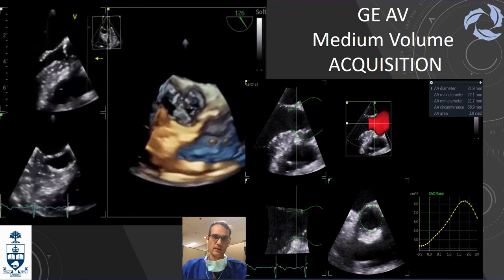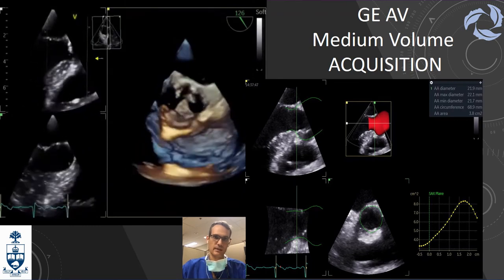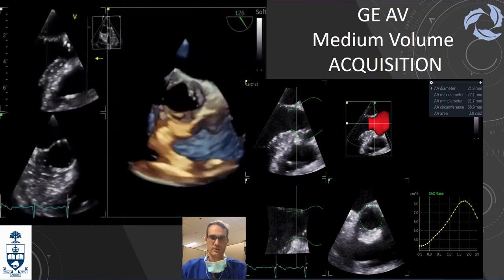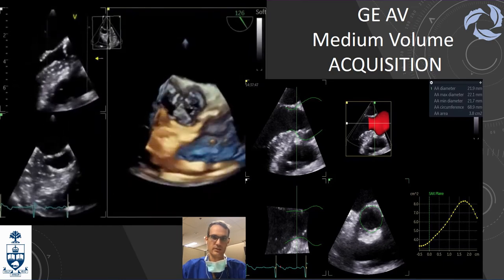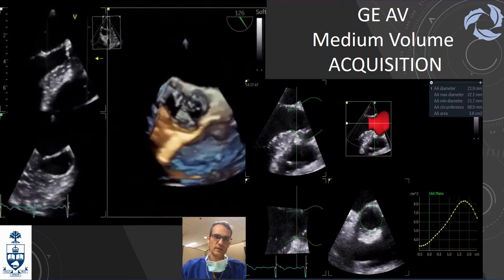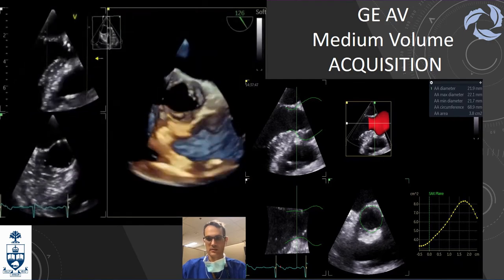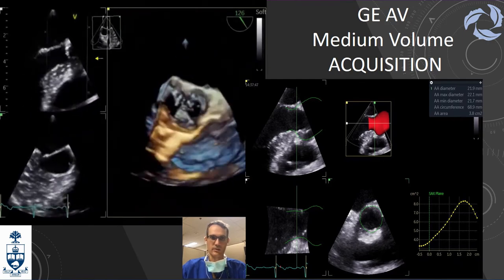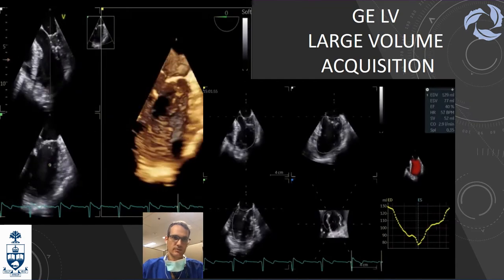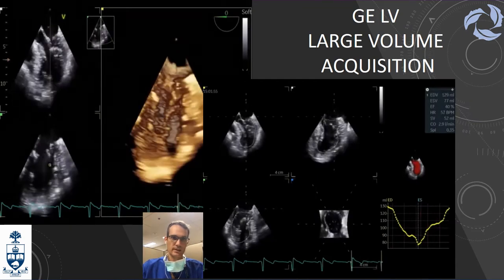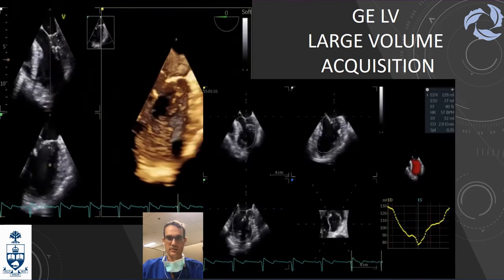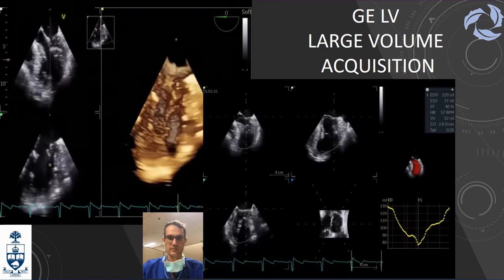When you go to large volume, it's normally recommended to get the whole left ventricle inside. With that you can generate a 3D ejection fraction with end-diastolic and end-systolic volumes, stroke volume, and cardiac output.